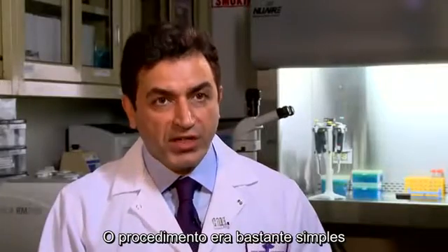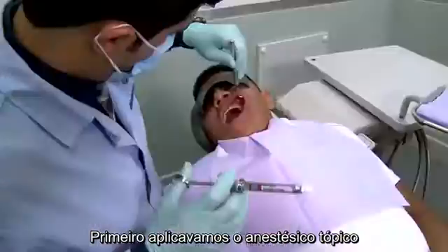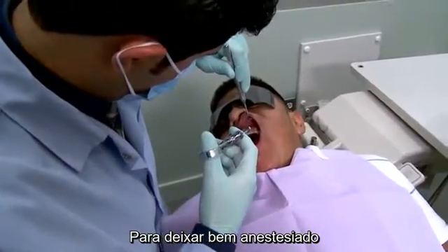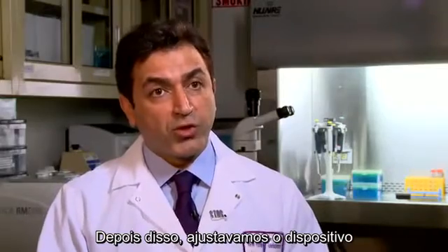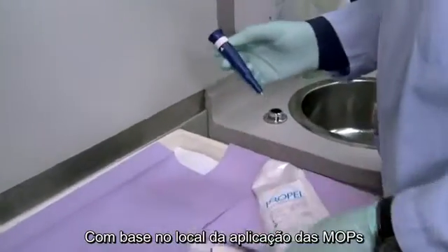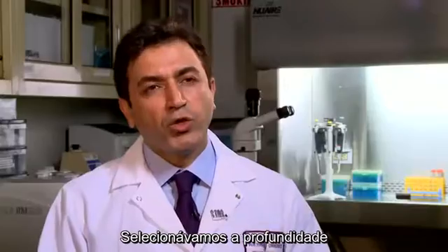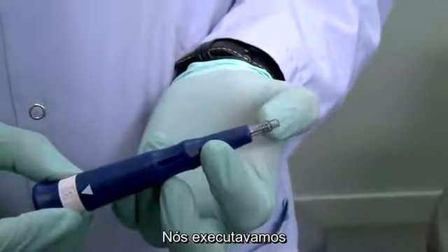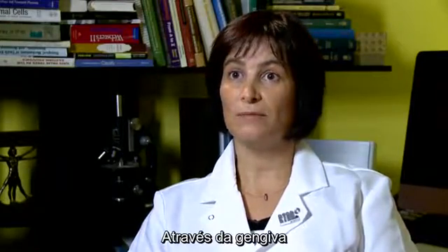So the procedure is very simple. First, you apply a topical. Then you do a local infiltration to make it a little bit more numb. After that, you adjust your appliance. Based on where you want to apply your appliance, you can select your depth. You need about 2 or 3 millimeters inside the bone. That's enough. We perform the micro-osteoperforations through the gum.